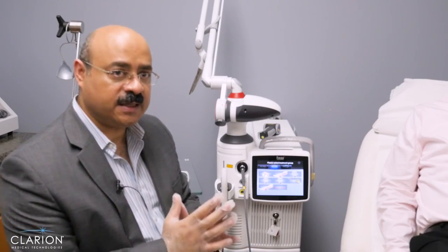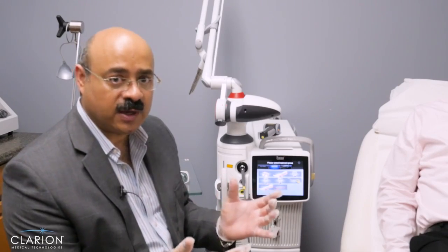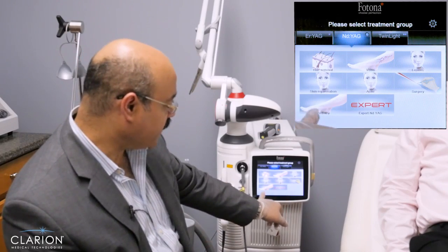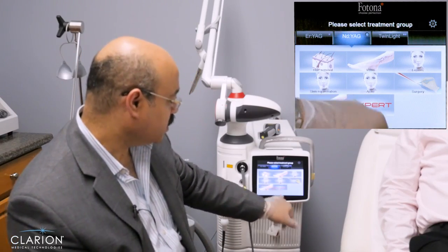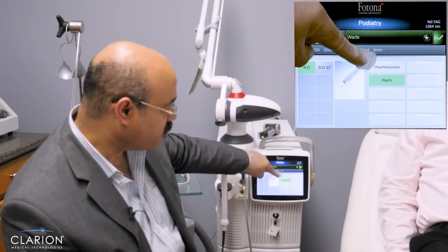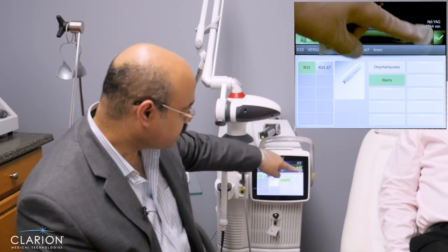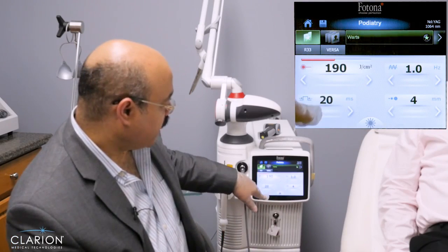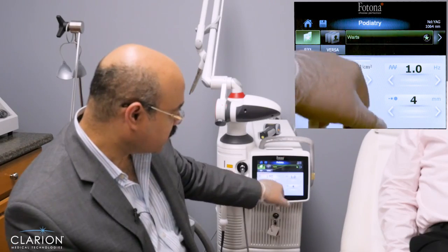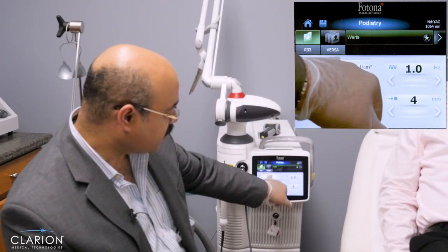We are going to go to the machine interface now, because we have preset options which are really nice to follow and use. We select the Nd:YAG, go to the podiatry application, then to options, where we see two choices: onychomycosis and warts. We select warts, and the machine suggests using a four-millimeter spot with the R33 handpiece, 20 milliseconds and 120 joules, stacking pulses two, three, four, or five times until we see photocoagulation.